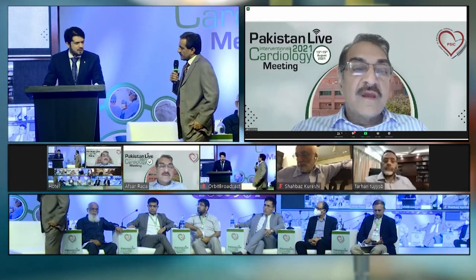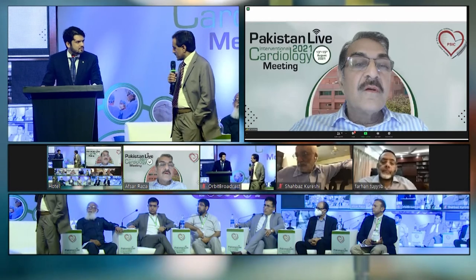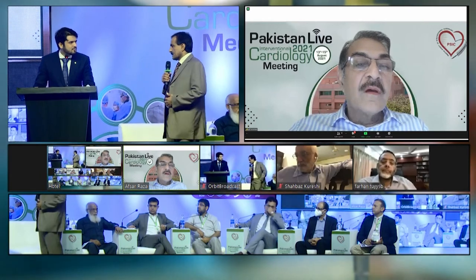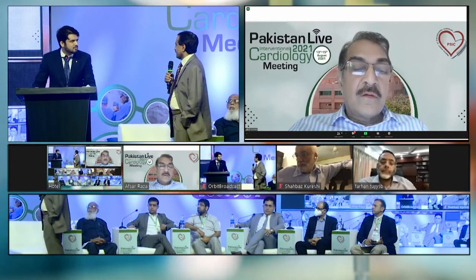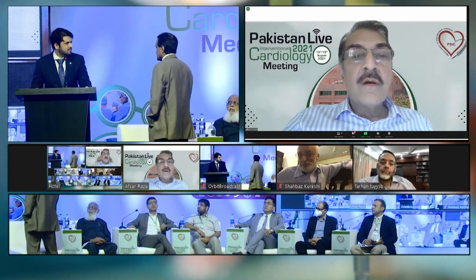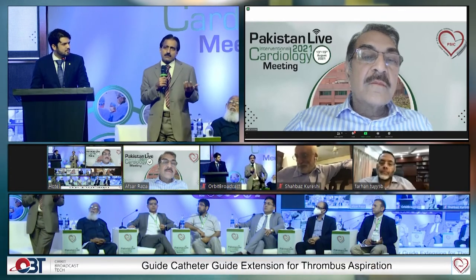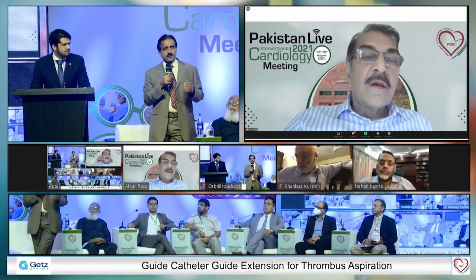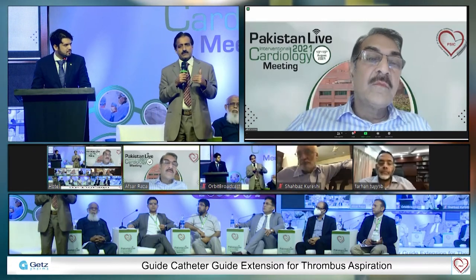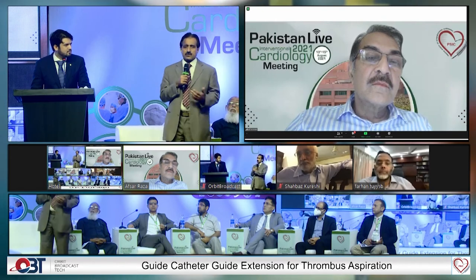You see, from yesterday also, all the CTO operators were talking about it, that we should not be doing the vein grafts anymore, especially if it is already 10 to 15 years old. This is the best way. Again, we have limited operators, but the retrograde, I know antegrade may be difficult, but going through the graft and getting the retrograde, there are very nice collaterals over there.